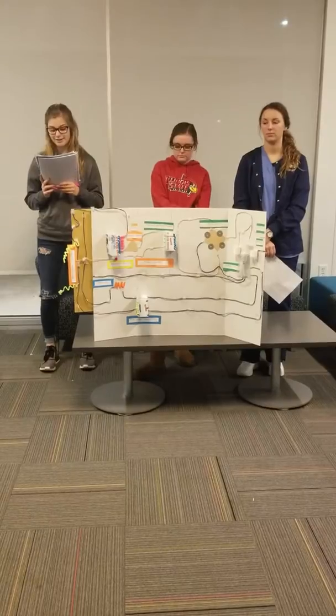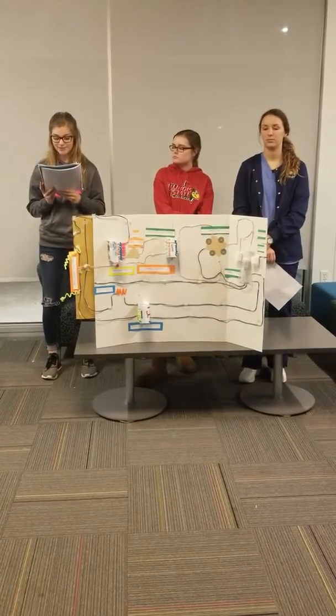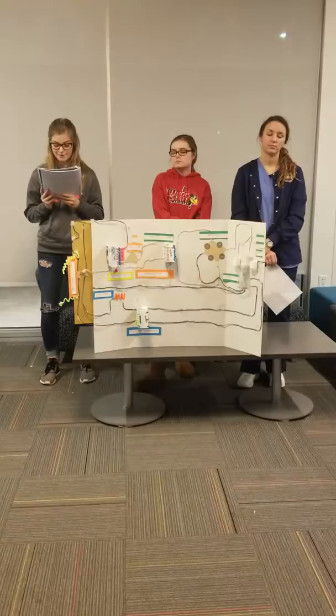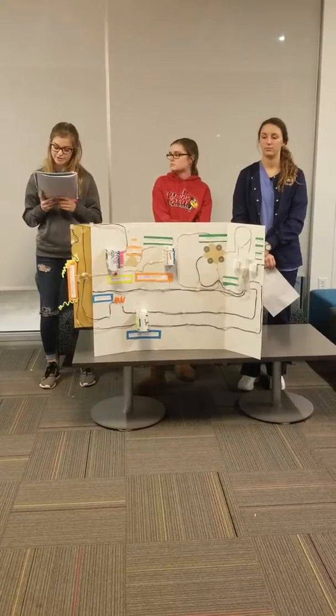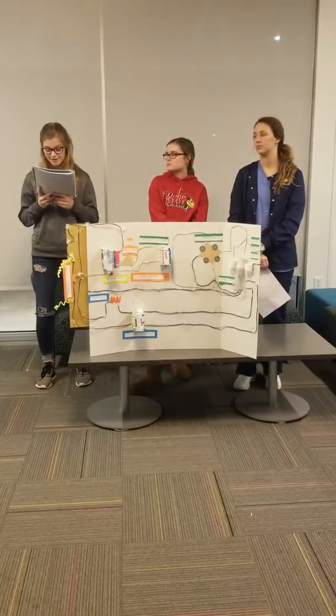The timer circuit for the exposure timer is located in this section because it's easier to control a low voltage rather than a high one. It includes a synchronous timer and an electronic timer. Also an AEC device, which serves the same role as a timer. The patient's body part of interest is the variable in determining when to terminate exposure.